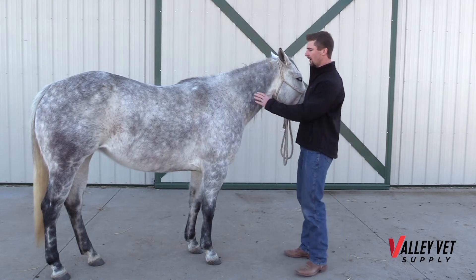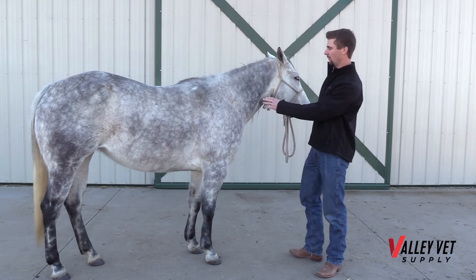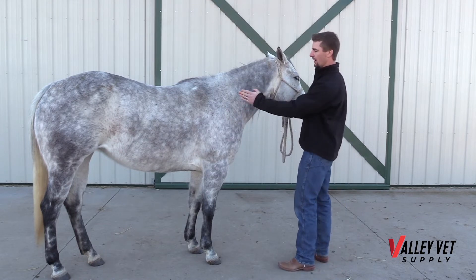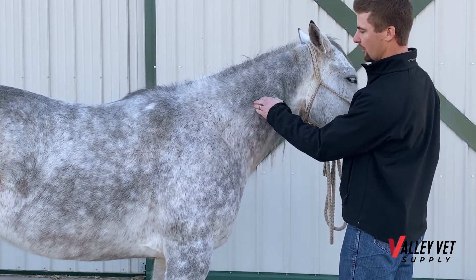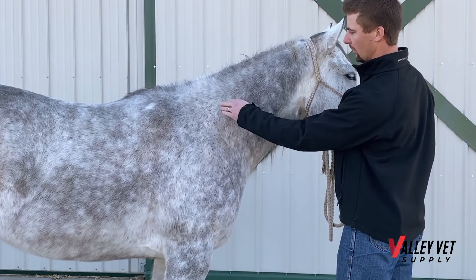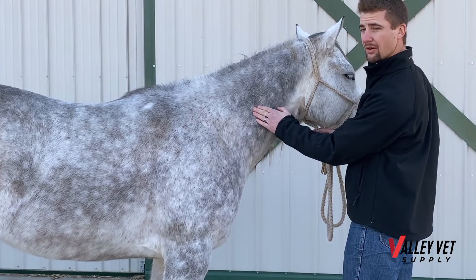The most common site is going to be on the neck. We talk about an injection triangle — the landmarks are right in front of the shoulder blade, above the vertebrae, and below the nuchal ligament. So your injection triangle is going to be in this area right here.